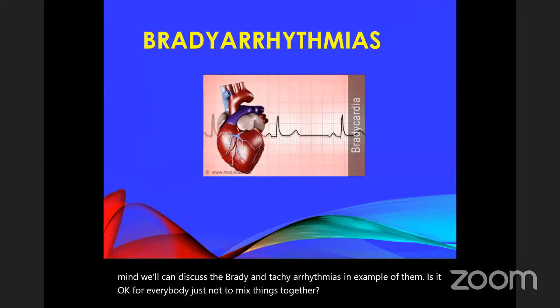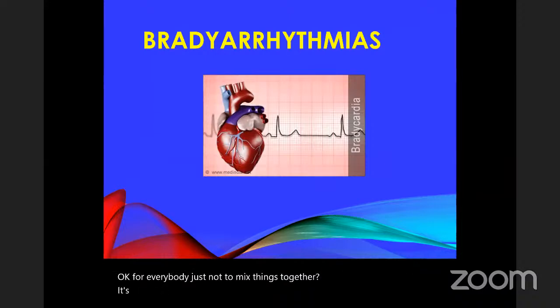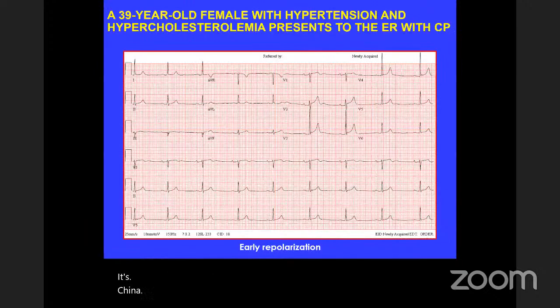Dr. Bender, I have a question on ST elevation and ST segment changes. As you said, if there is ischemia, we'll see some ST depression or other changes. If there is an injury, we'll see ST elevation, and if there is infarction already, we'll see Q wave.